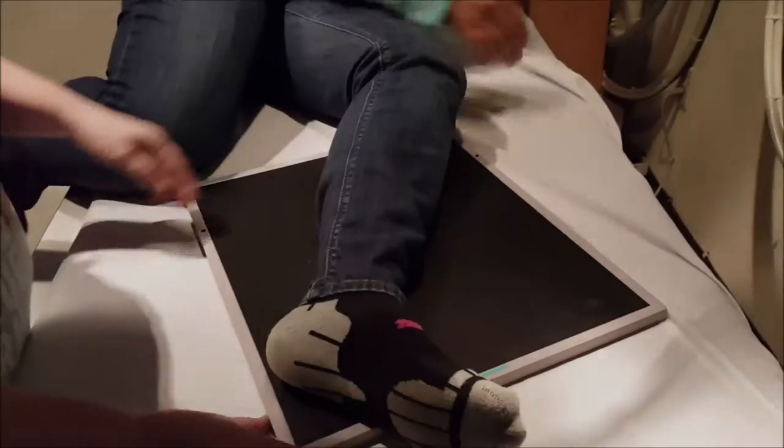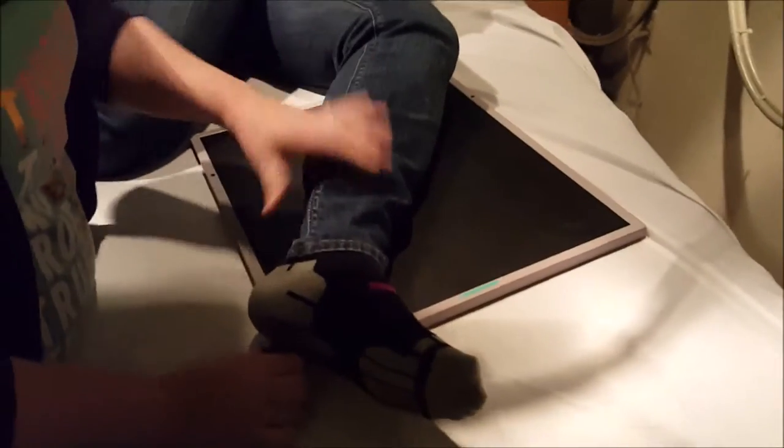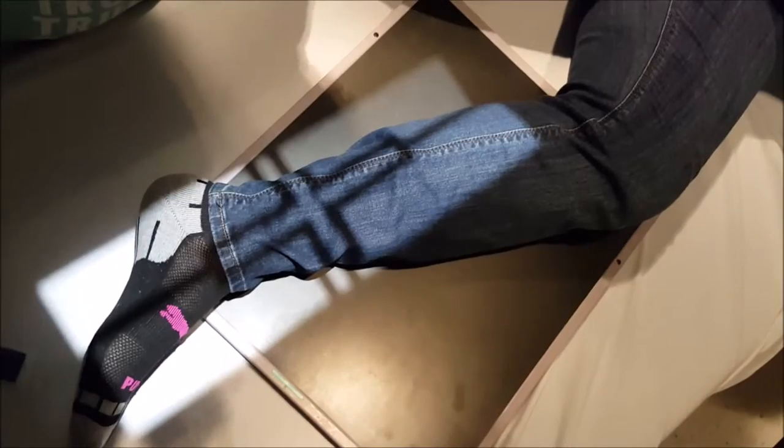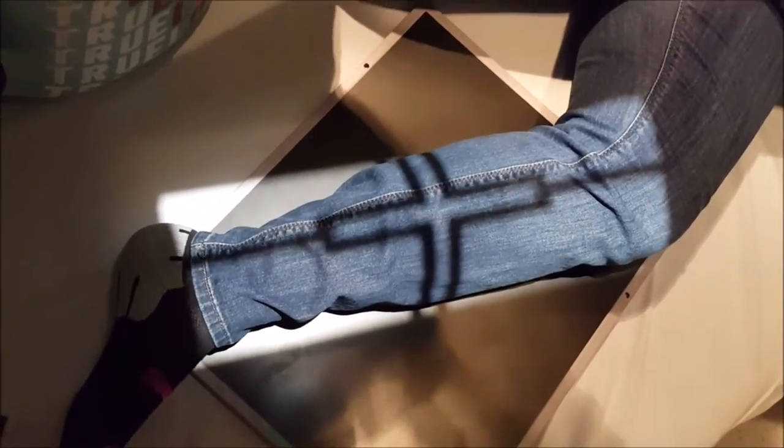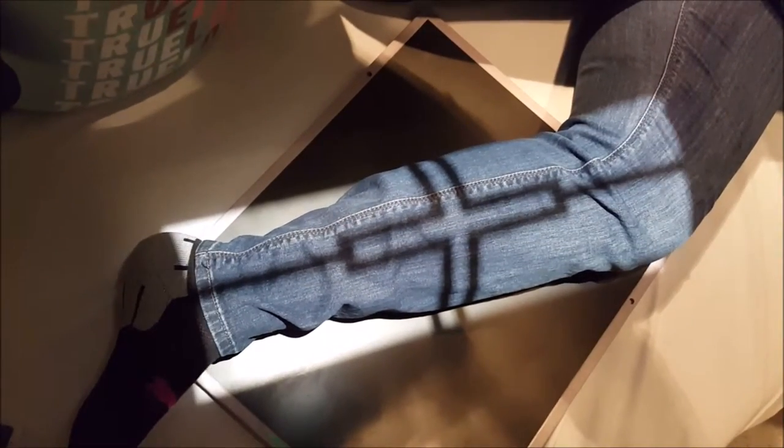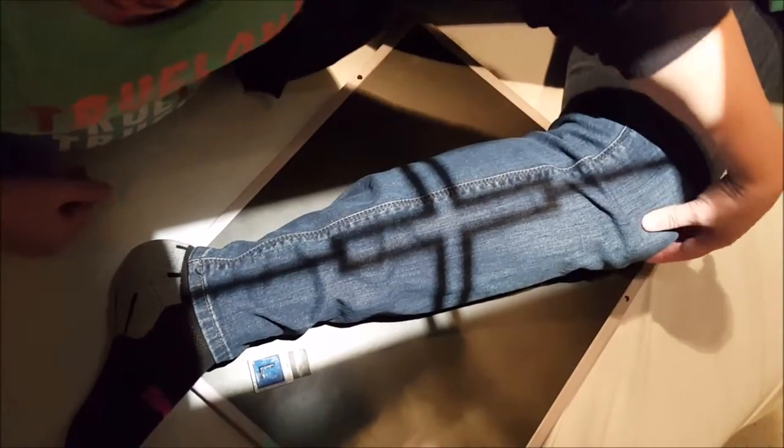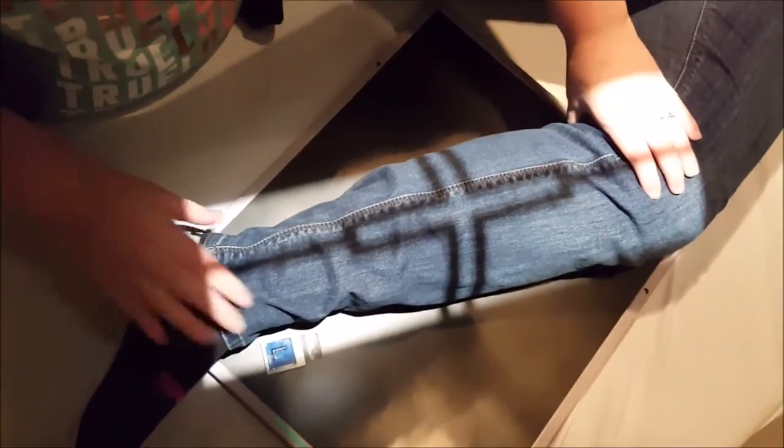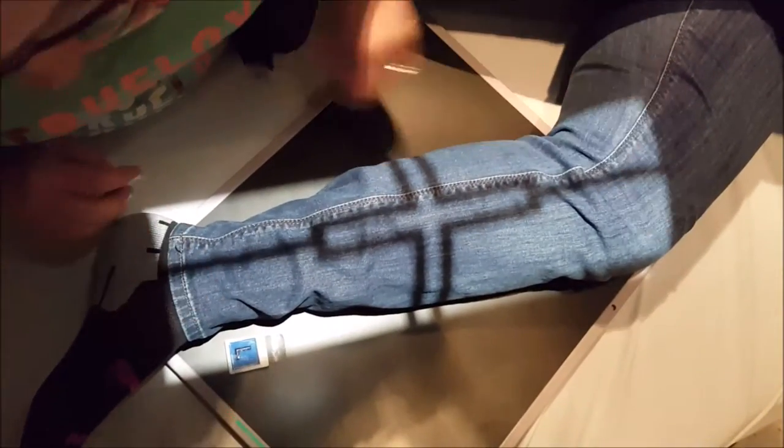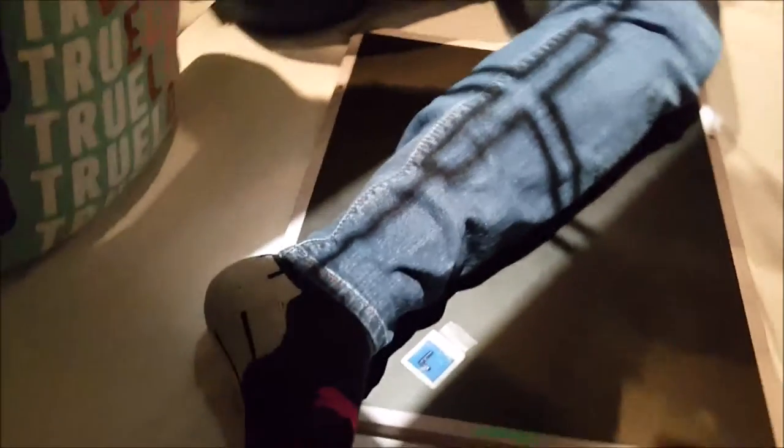For the lateral lower leg we're going to use the same concept where we're going to use the diagonal axis of the IR to help us here. So we're going to need to get from the ankle to the knee. I know that my 43 inch SID worked for me last time, so I'm just going to keep the same SID. I have light in the back and light in the front, I'm going to keep my marker on the lateral side. So you want to try to get the knee as lateral as you can, and make sure the ankle stays lateral. So that's about lateral there. I am going to open my collimation just a little bit though.